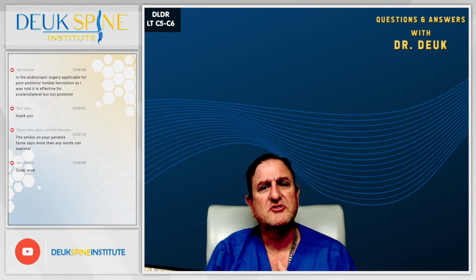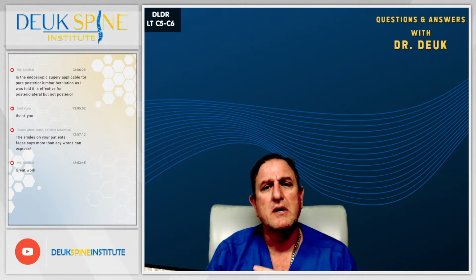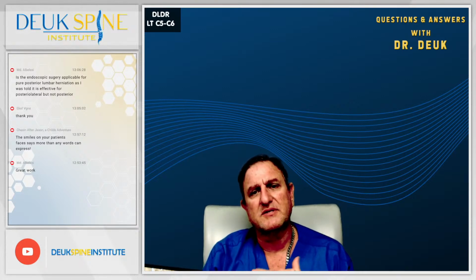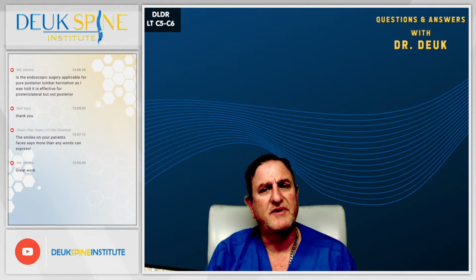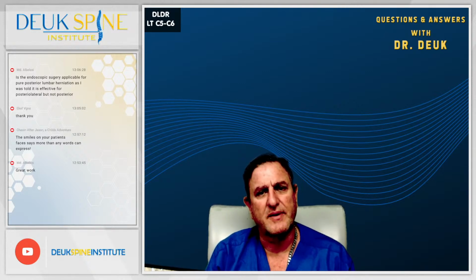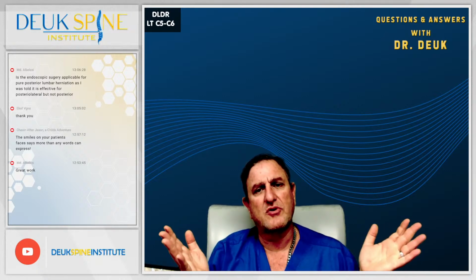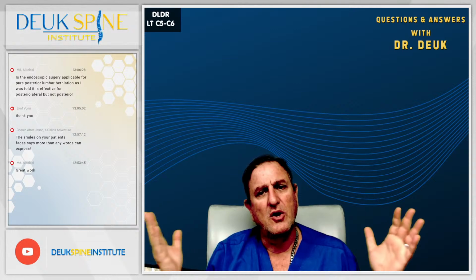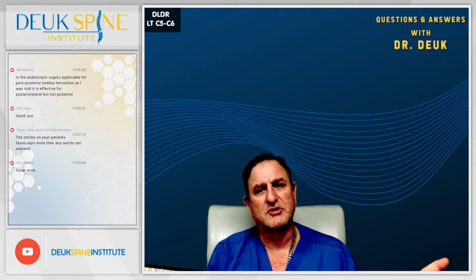Yes, the Deuk laser disc repair that you're watching. I can't speak about other endoscopic surgery because, frankly, that other endoscopic surgery is not as good as what we do. We perform the most advanced and the best endoscopic surgery. With our surgical techniques, we can get to a posterior disc herniation. More importantly, we can eliminate any symptom from a lumbar disc herniation.